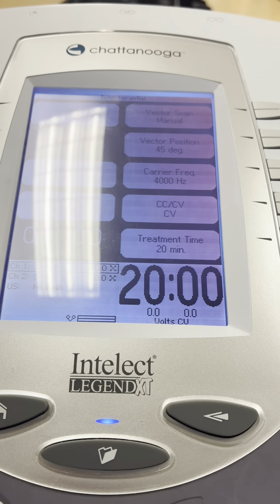Alright, so we'll go ahead and start our treatment here. I'll set the intensity at 2.0, and then we're going to crank it up from there.